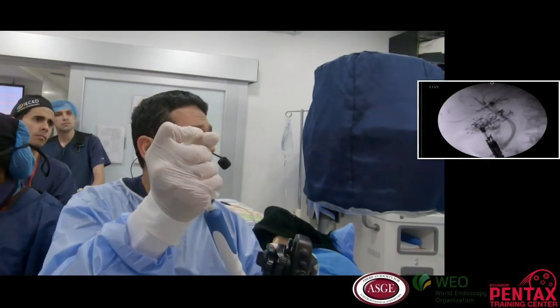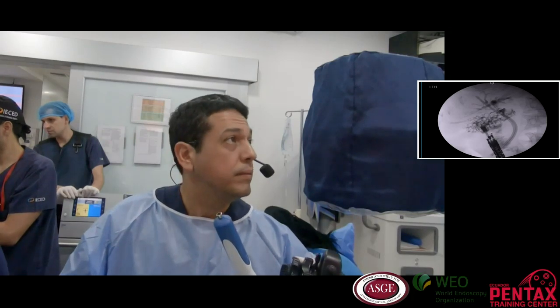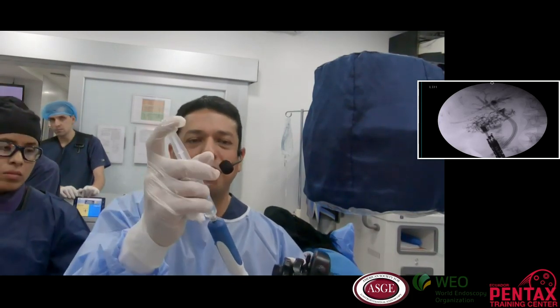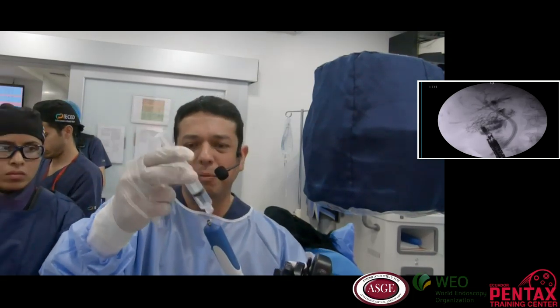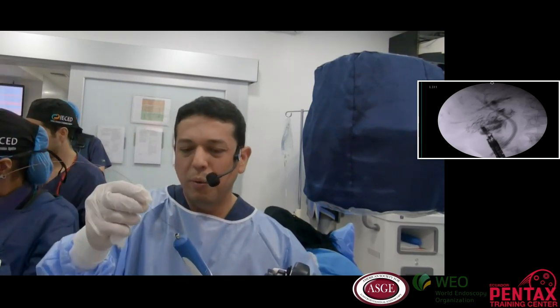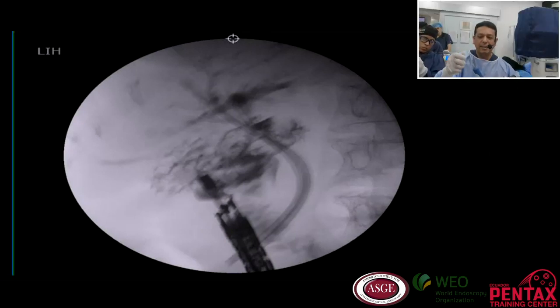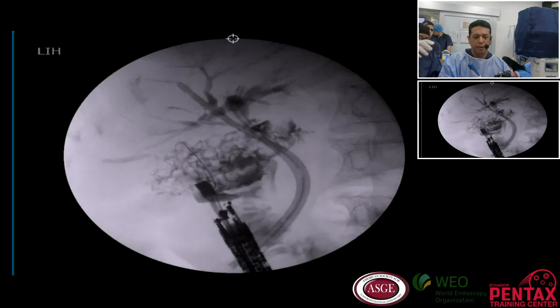Look, the whole gallbladder is okay. Water, agua. So that's the reason. The problem is that this patient already has a cholecystitis, but not a symptomatic cholecystitis. And we are not looking at this problem. And these patients, we don't see in the follow-up because we lose them when they go with the surgeon. And at the same time, after the surgery, because of the cancer, this patient will have a complication. This is an excellent explanation. And that's the reason why. So I will pass my guide wire like that. I am very good now. Empuja.